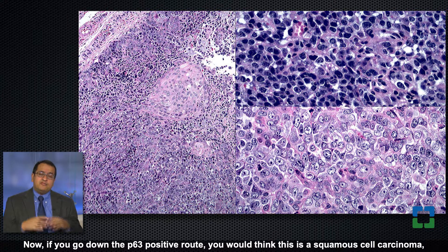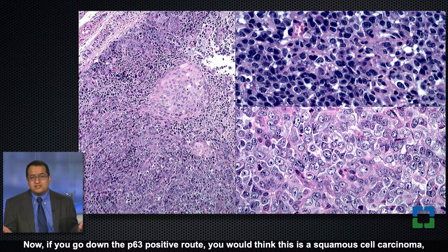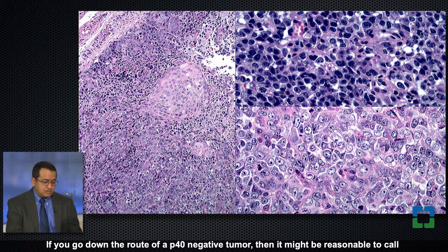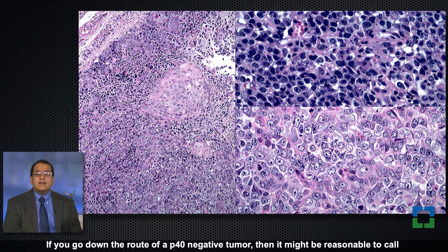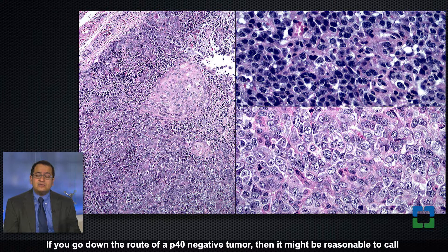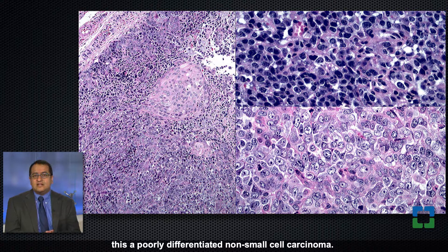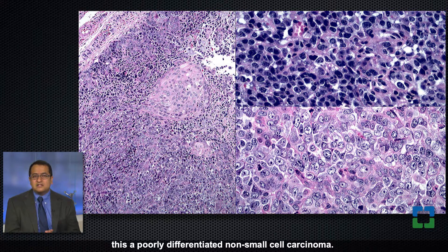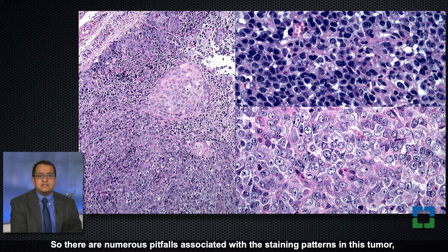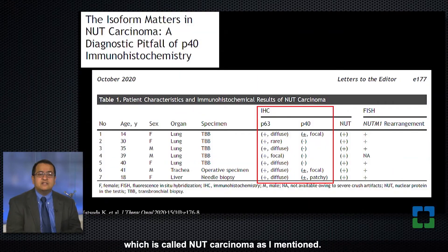If you go down the p63 positive route, you would think this is a squamous cell carcinoma and might diagnose it as such. If you go down the route of a p40 negative tumor, it might be reasonable to call this a poorly differentiated non-small cell carcinoma. So there are numerous pitfalls associated with the staining patterns in this tumor, which is called NUT carcinoma.